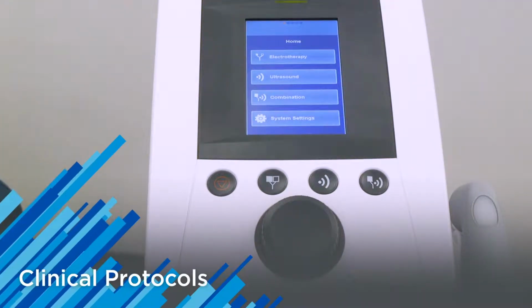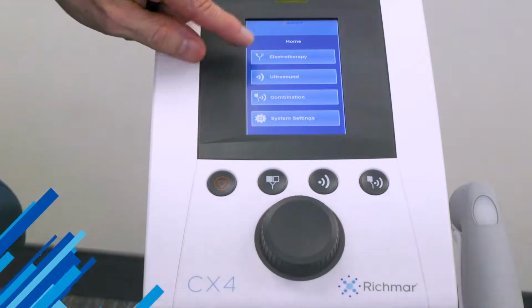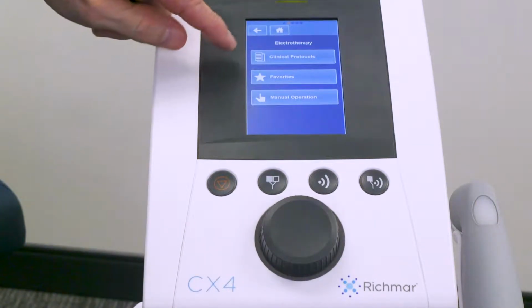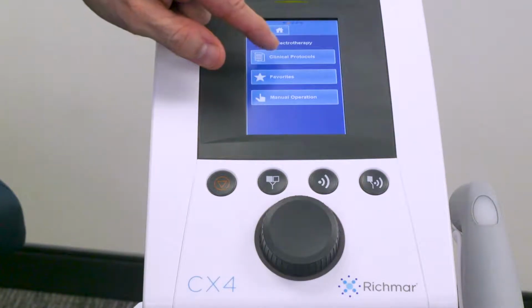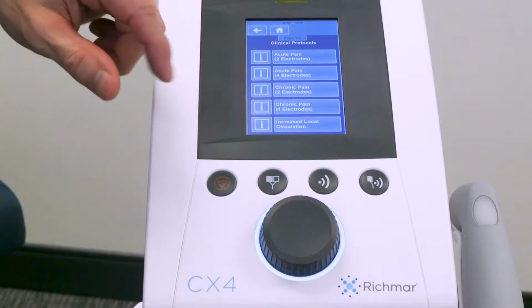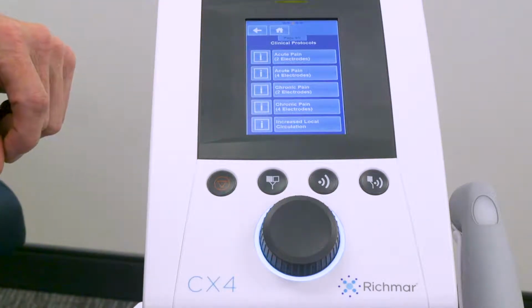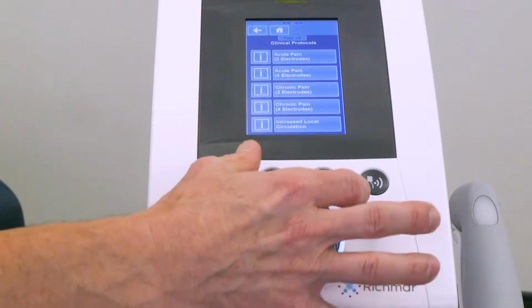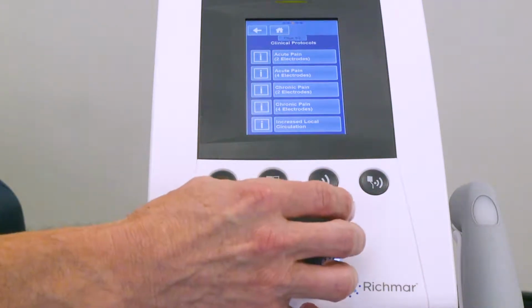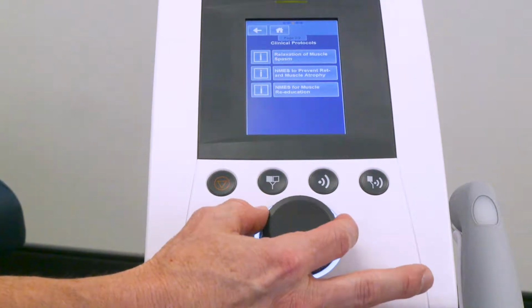To access your evidence-based clinical protocols for electrotherapy, you're simply going to select the electrotherapy modality option from the home screen and then select the clinical protocol menu. Once you land into the clinical protocol menu, you're going to see 2 pages of evidence-based protocols for electrotherapy, indicated by an LED that lights up for a second page. You simply take the dial and you turn it to the second page.